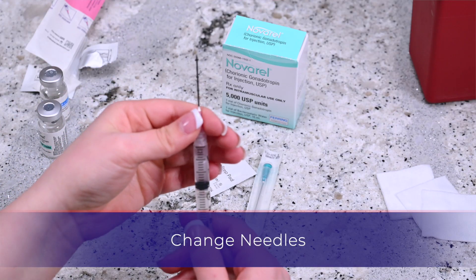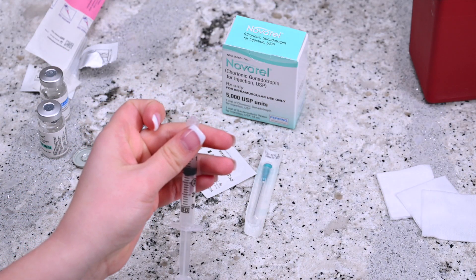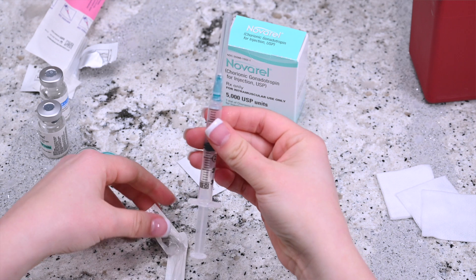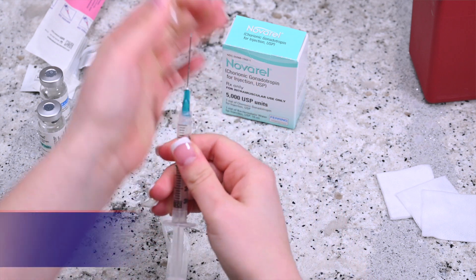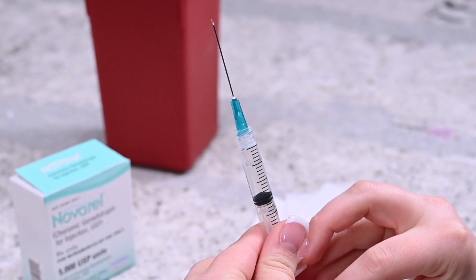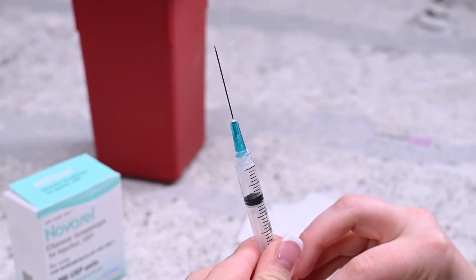Gently twist and remove the needle from the syringe. Dispose of the needle, placing it into the sharps container. Attach the intramuscular needle and remove the cap. Don't let the needle touch anything, including your hands. While holding the needle upright, gently tap the side of the syringe until the air bubbles migrate to the top. Apply slight pressure on the plunger until a drop of liquid appears at the tip of the needle.